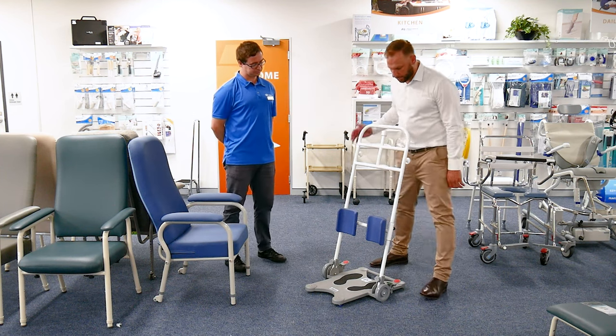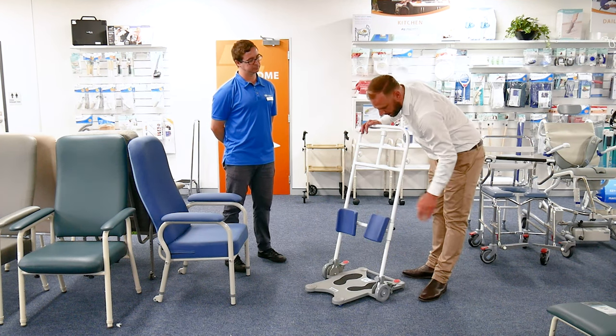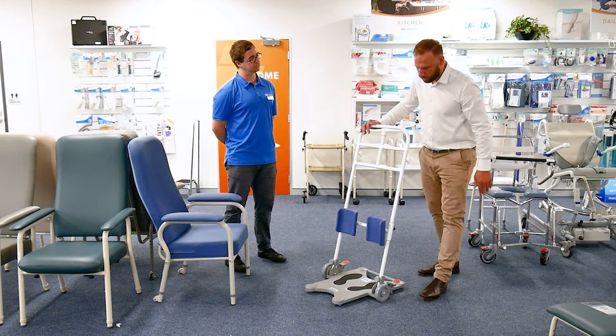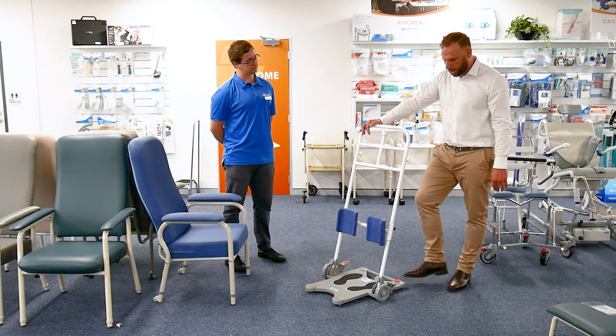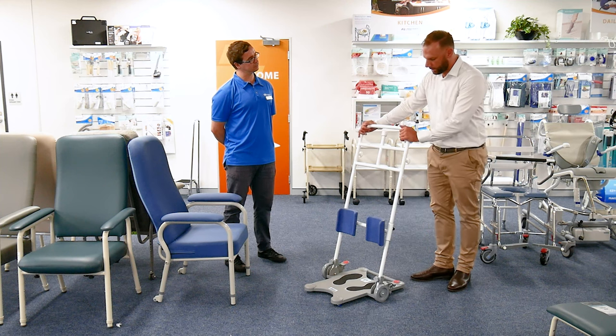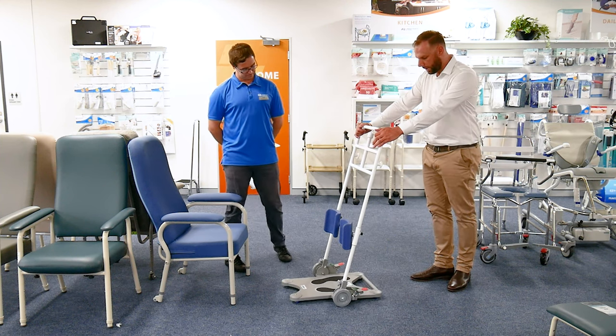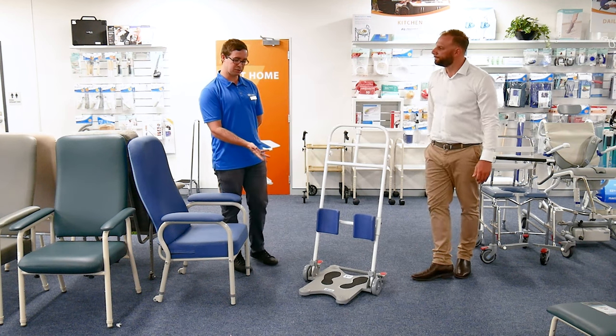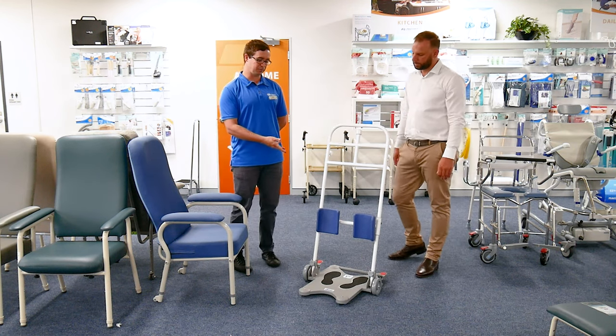Some additional features: you've got your leg blockers here, which have some angle adjustment to move with the client as they're shifting. There's a brake system, which is self-explanatory. Safe working load is 150 kg.